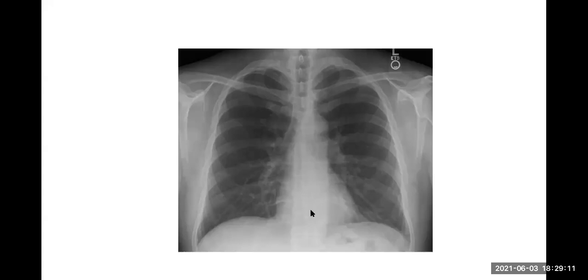So you can remember it as ABC. Airway and lung fields, blood vessels, and also bone. You don't need to look at that at that moment, but you can look at the bones also. And then C is cardiac shadow, and then D is diaphragm, and everything above and below. So if you remember A, B, C, D, that is fine. Airway and lung fields, A. B is blood vessels and bone. Bone will be mainly clavicles and ribs. Then C is cardiac contour, cardiac shadow, and D is diaphragm. That is the way you usually approach looking at a chest X-ray.